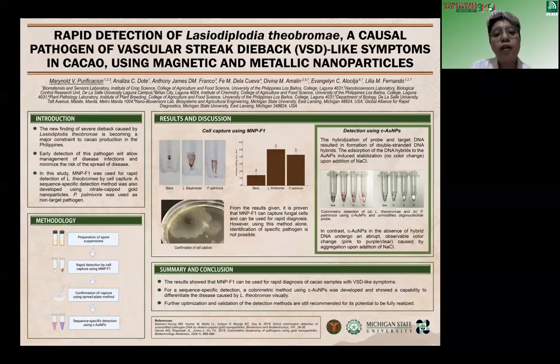From these results, the method showed a capability to differentiate the presence of Lasiodiplodia theobromae from another fungal pathogen visually. However, it should be noted that optimization and validation of these detection methods are still recommended for their potential to be fully realized.